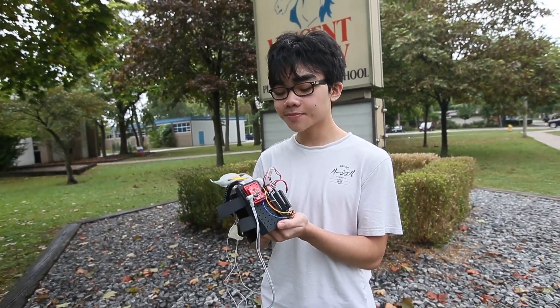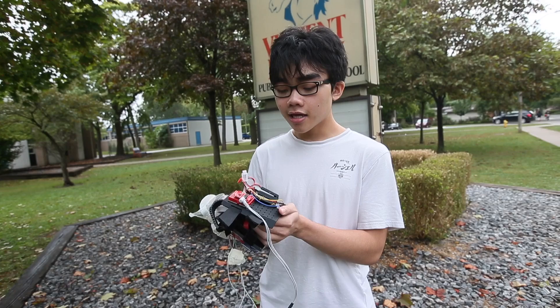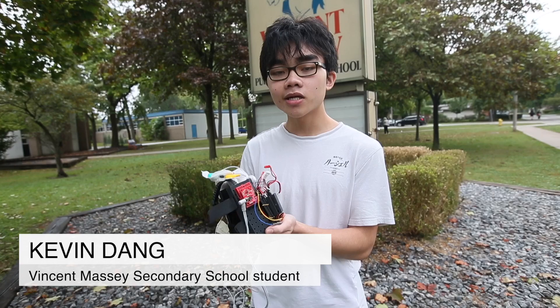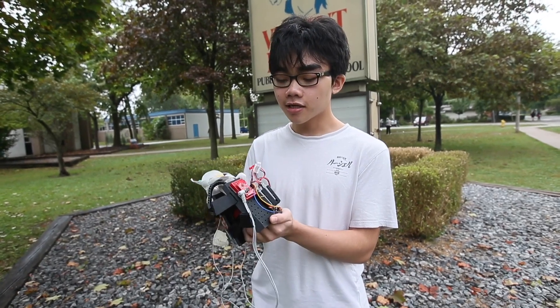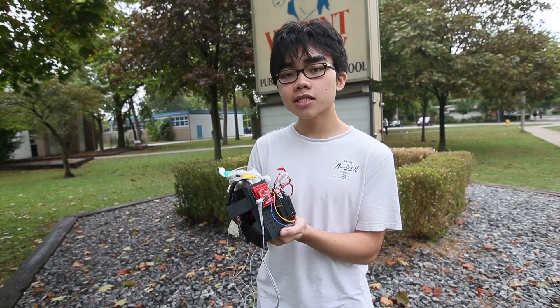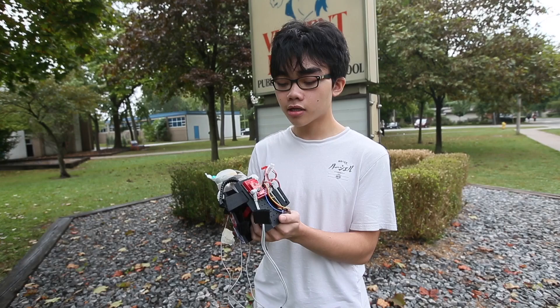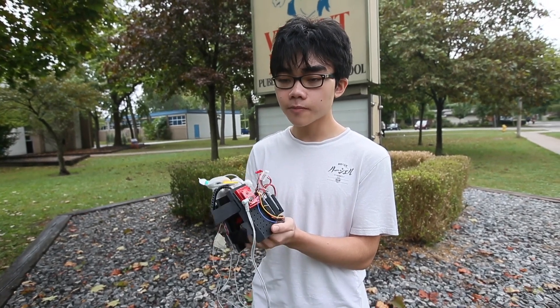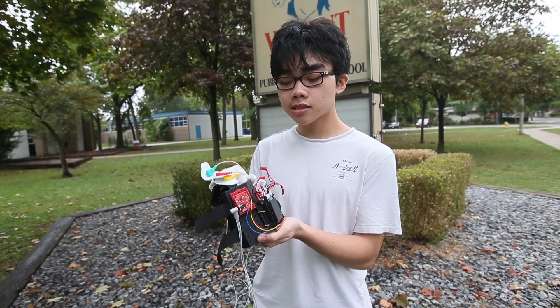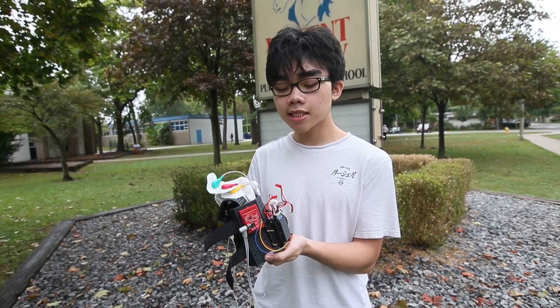I created this bionic arm to help paralyzed people grasp objects. When designing this project, I used computer-aided design software called Fusion 360. I mainly focused on the comfort of the arm, as well as making it modular, which means I can switch out parts easily.